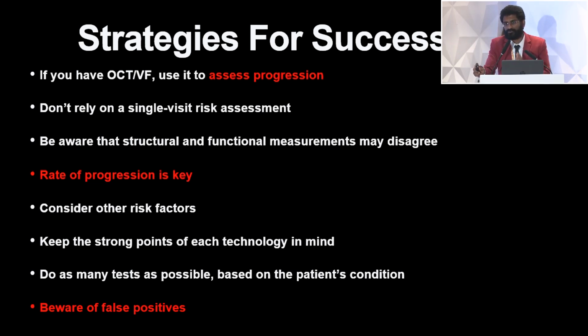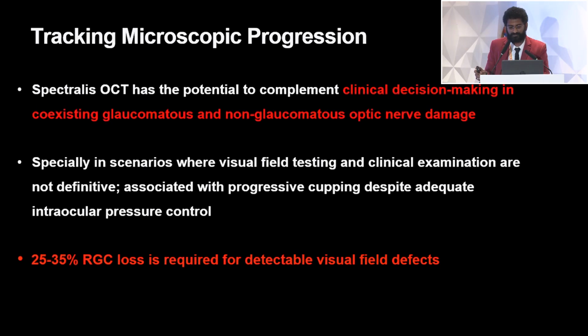It doesn't mean we need to do everything for that patient. And beware of false positives, my dear friends, because that is a very important takeaway. We think there may be a disease, but there might not be a disease as well. So these are some of the examples I wanted to show.